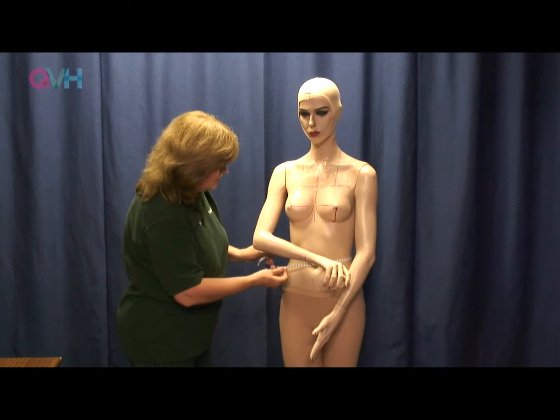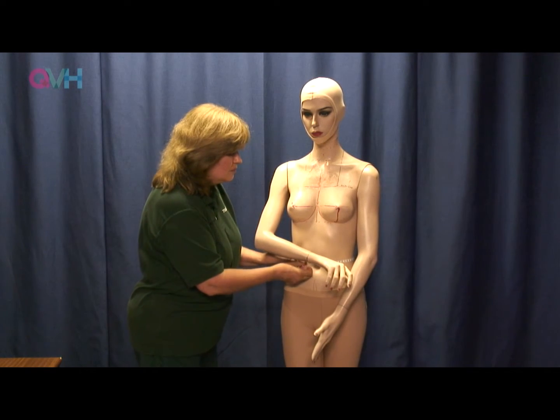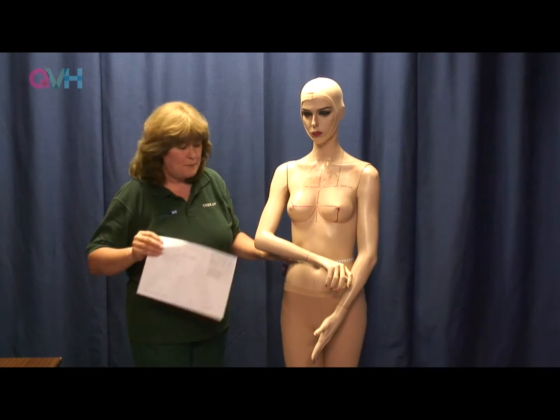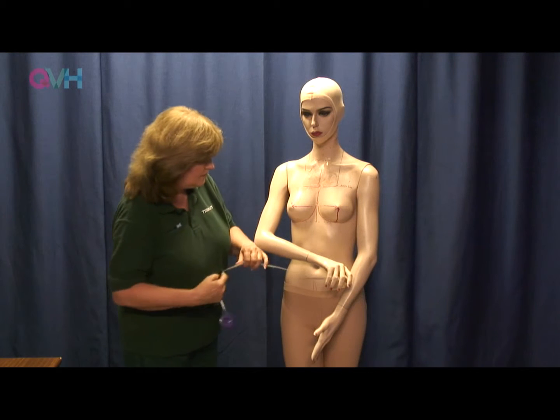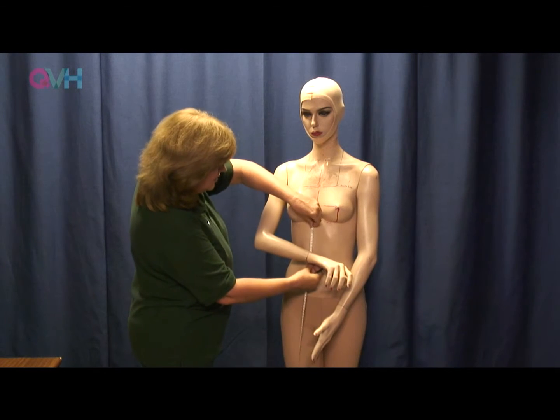It's much harder, of course, on this mannequin, but you notice that that datum point is easy enough. It's the natural waistline, and it is the one just above the navel, which you'll probably look at quite carefully on this piece of paper. And if you mark that position and record the measurement, you can then decide how many divisions you want between there and there.